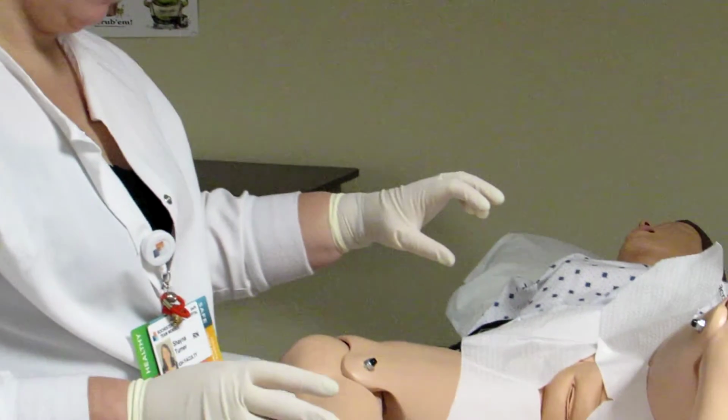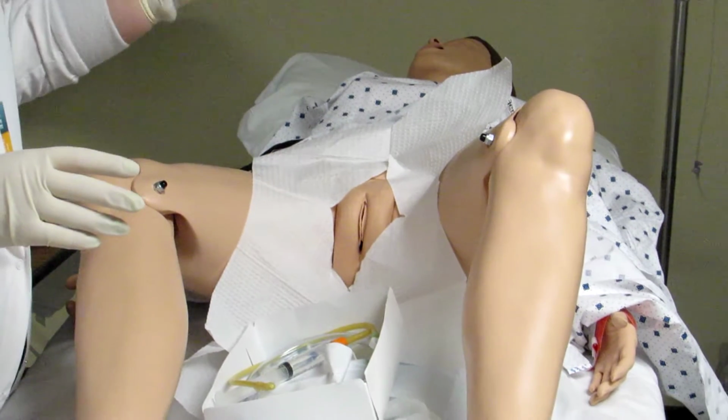Once I put my hand here and I spread the labia and I clean the labia, remember that hand has to stay there, whether you're holding the penis of a man or holding the labia open of a female. Your hand has to stay there and it's considered dirty. Okay?